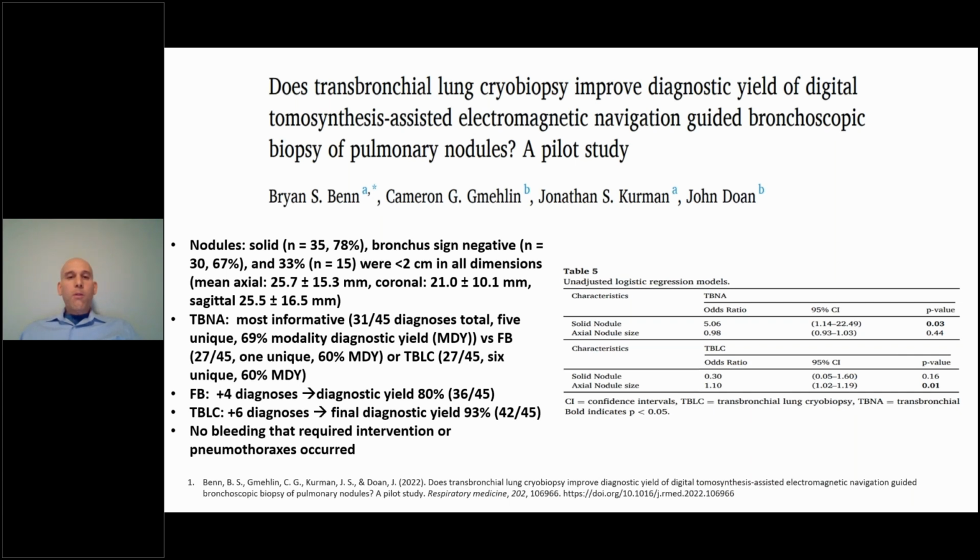Fortunately, with cryobiopsy being performed, we had no interventions that required anything being done for bleeding, and no pneumothoraces occurred as well. So it was also, fortunately, a safe procedure.